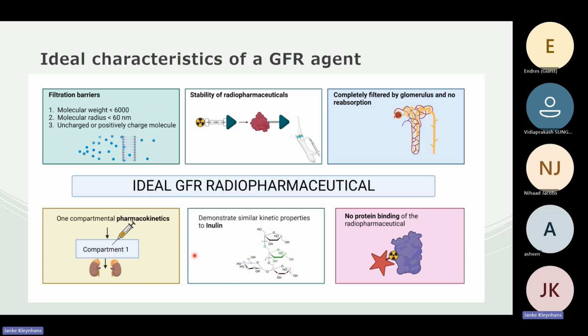And there should be no protein binding of the radiopharmaceutical. Because as you know, if it binds to the proteins, there is delayed excretion and it stays longer in the blood and then you get false measurements.